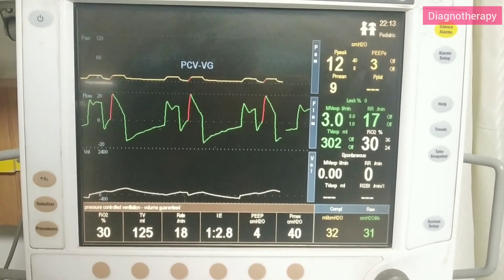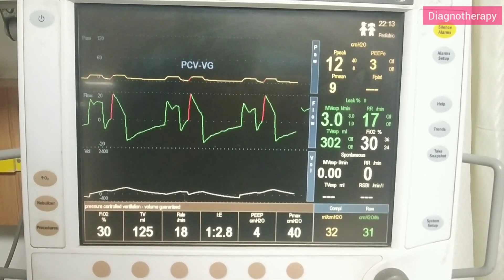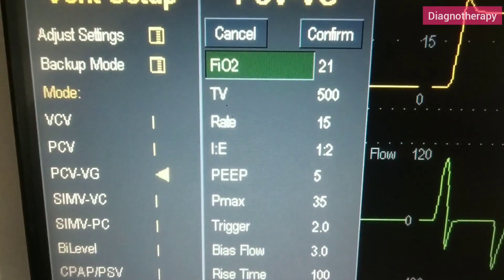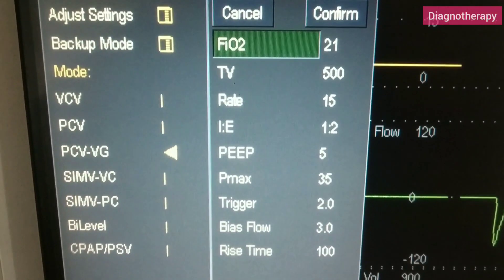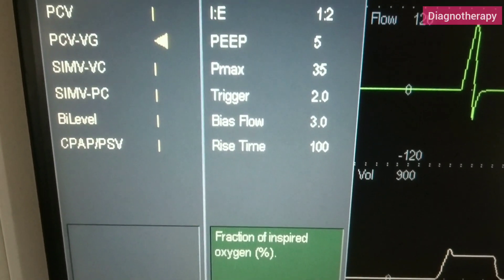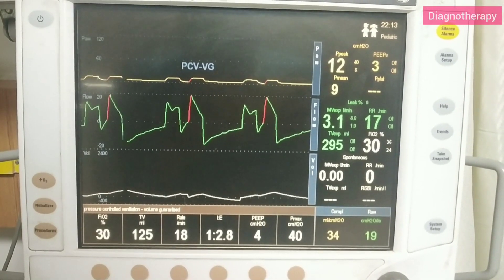Now let's see the settings of PCV-VG ventilation mode. Going to vent setup and then going to PCV-VG. Here we can set the FiO2 value — fraction of inspired oxygen — tidal volume, rate, I:E ratio, PEEP (positive end-expiratory pressure), Pmax, trigger, base flow, and rise time. After confirmation of the settings, the ventilator will start ventilating.